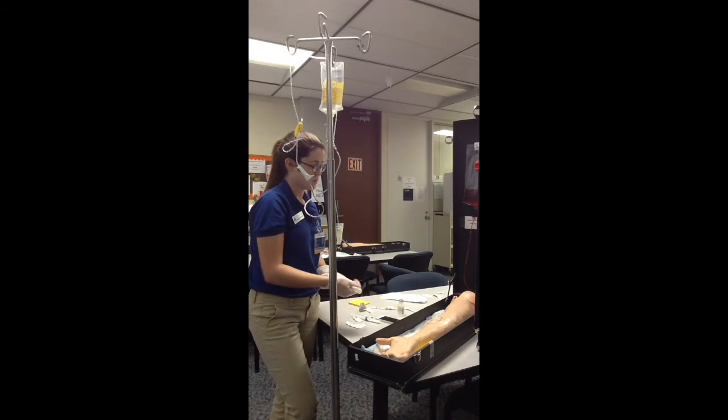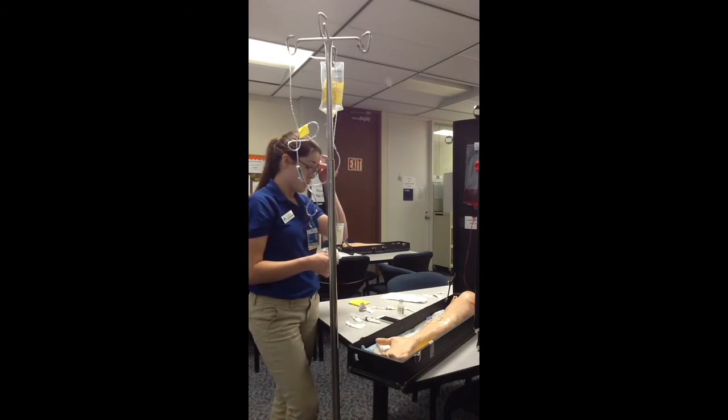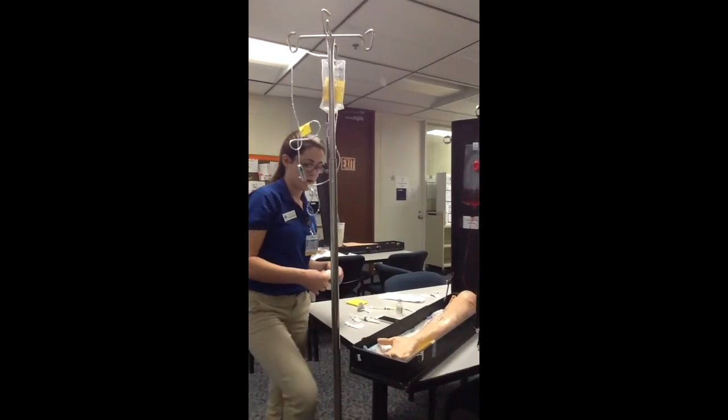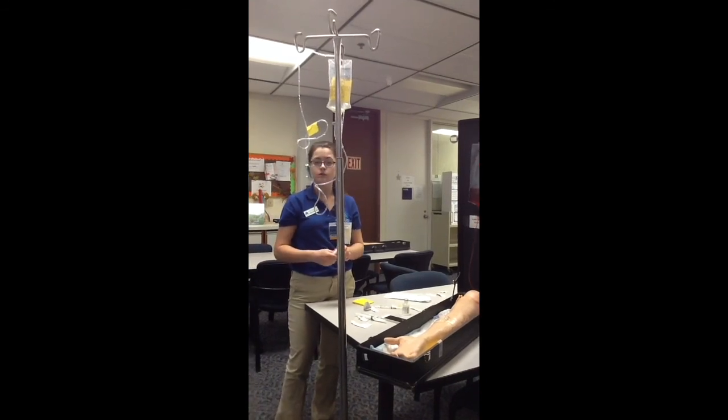And I would dispose of all my needles and syringes in the appropriate containers. I'm going to monitor the IV site for edema, pain, tenderness, redness, or any allergic or adverse reactions. And I'm going to document on my MAR the time, drug, dose, and route of the medication, the state and condition of the IV site, and I'm going to document in my intake and output. And that's it.